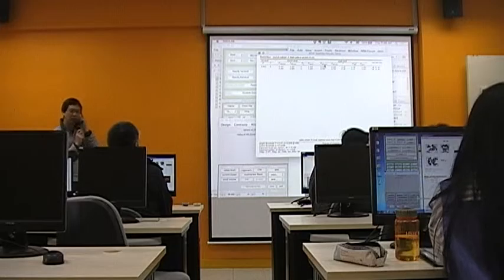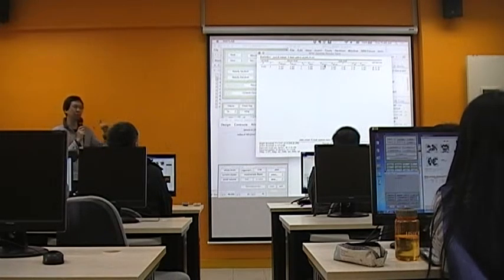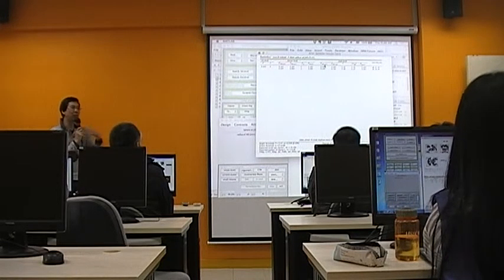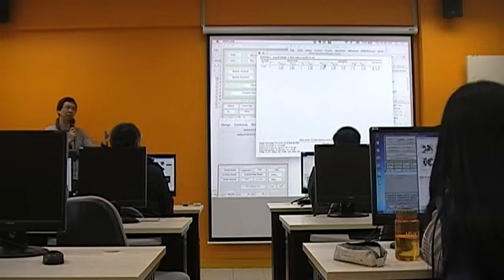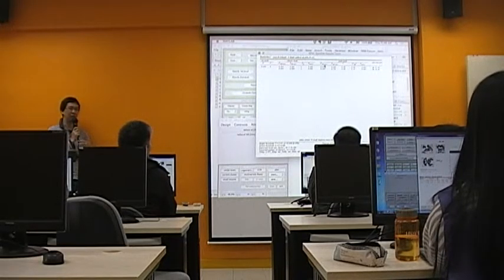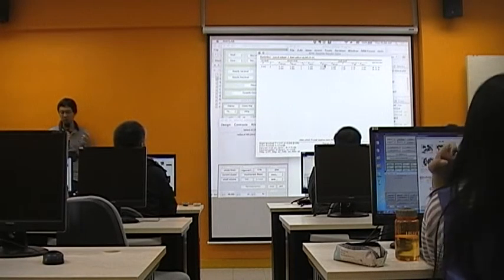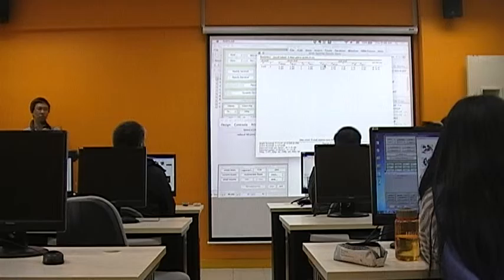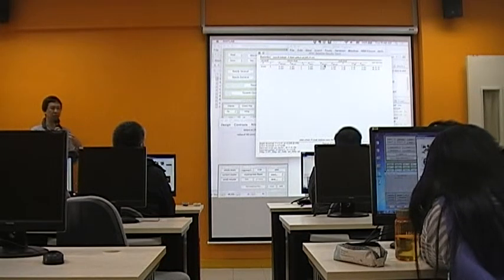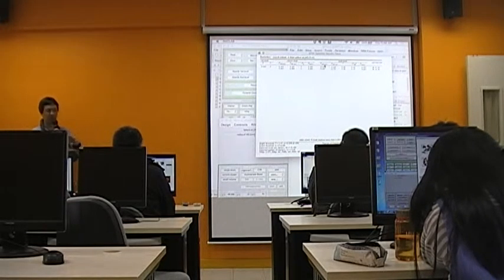Normally, if you have a bilateral region of interest, left and right, at least personally, I would test left and right separately, to see if maybe there are activations on only one side but not the other side. So you keep the possibility to search for a specific activation at one side of the brain.